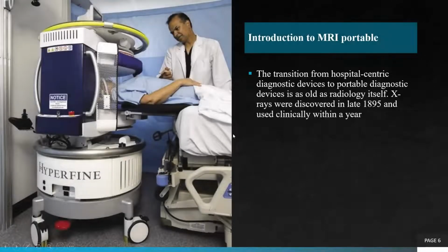Introduction to portable MRI. The transition from hospital-centric diagnostic devices to portable diagnostic devices is as old as radiology itself. X-rays were discovered in late 1895 and used clinically within a year. It became a mobile imaging technology in 1914 when Marie Curie encouraged the development of a fleet of X-ray equipped ambulances for use in World War I to aid surgeons in field hospitals.